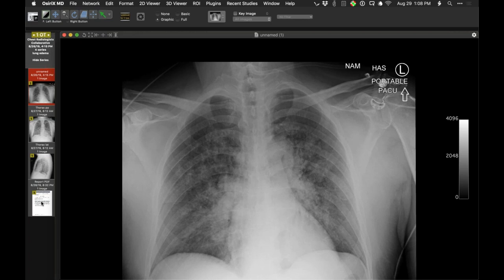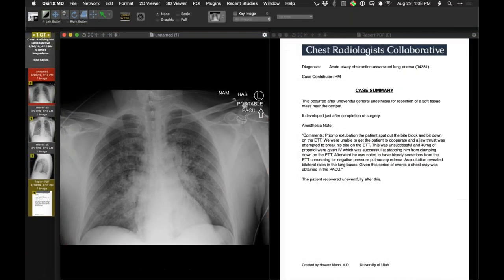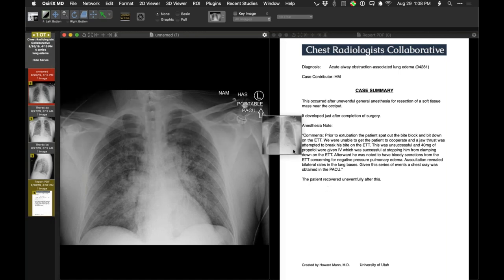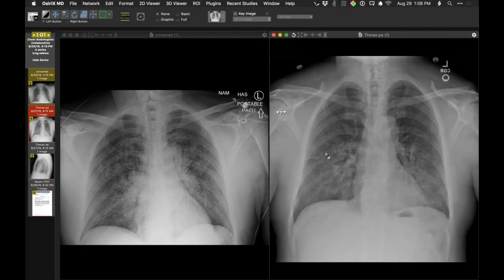Here is the really nice description from the anesthesia folks' note. You can see the timing of it, the occlusion of the ET tube, and what they had to do to relieve the ET tube compression. Anesthesiologists are quite aware of this. One would expect this to get better, as in this patient. They kept the patient overnight, perhaps just to be cautious. Even the next day, there is still some lung water — not entirely normal, but much better. He went home the next day. A really nice case of acute airway obstruction related lung edema, sometimes called negative pressure lung edema.